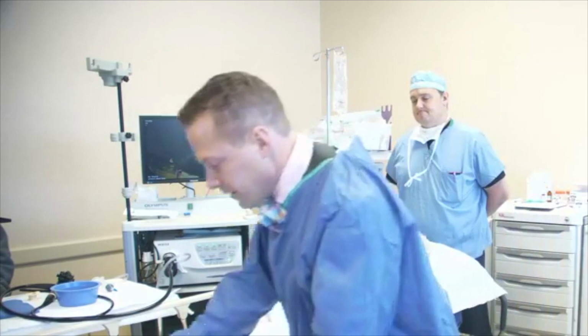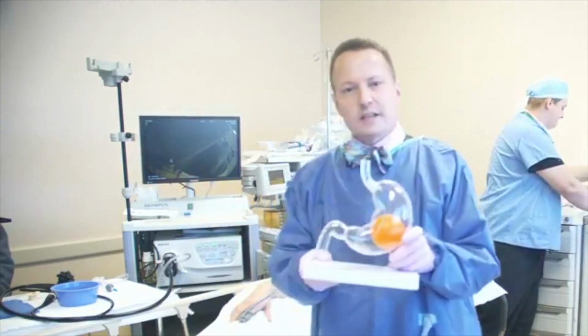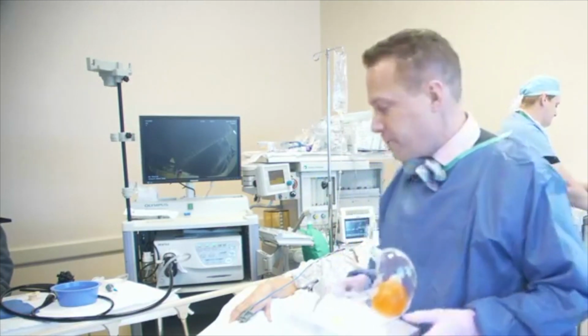This is a model, a replica, that would simulate, though the sizes are a little bit different, the size of the balloon within the stomach itself.